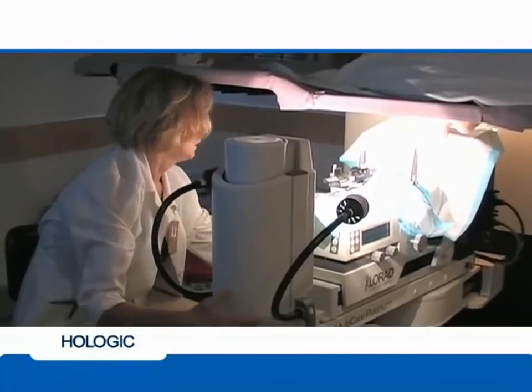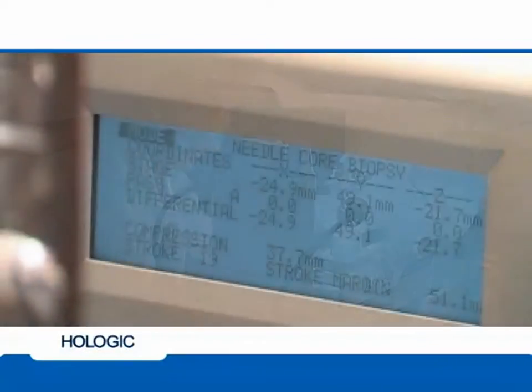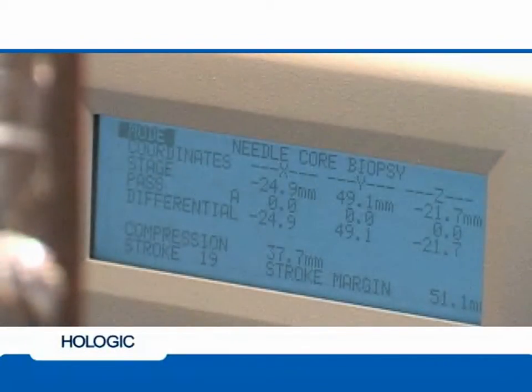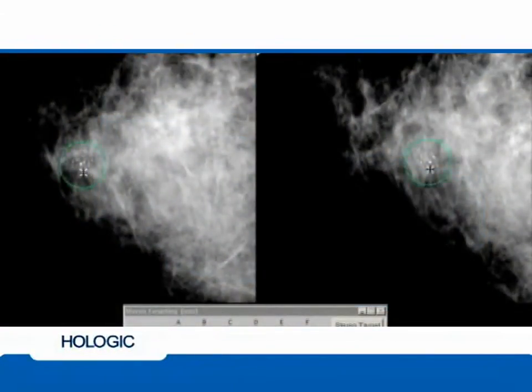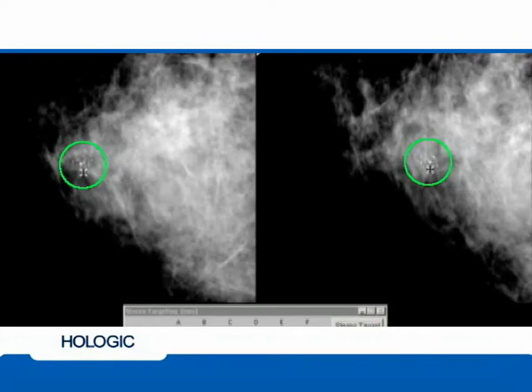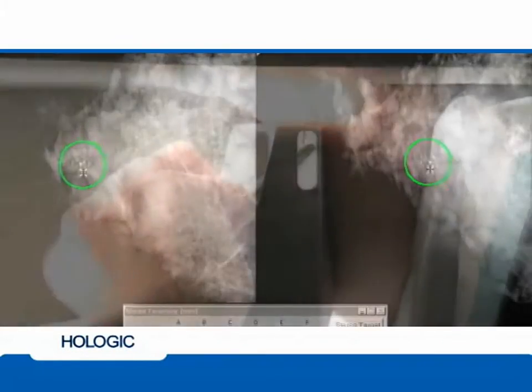A Cartesian coordinate system determines the precise position of the lesion in the x, y, and z planes. The area of interest is then targeted by the technologist or radiologist by marking the lesion location in both views of the stereo pair.